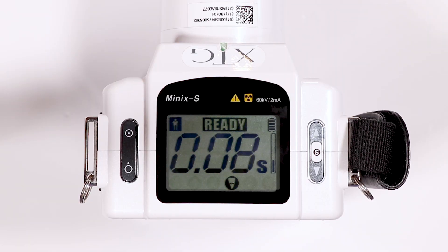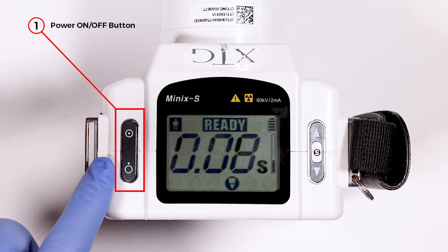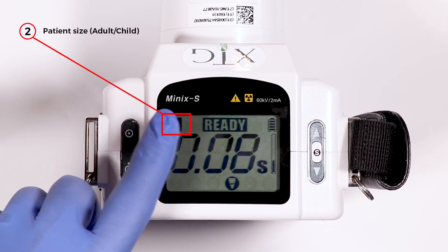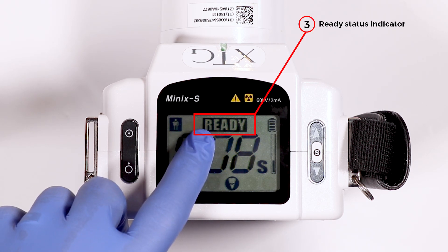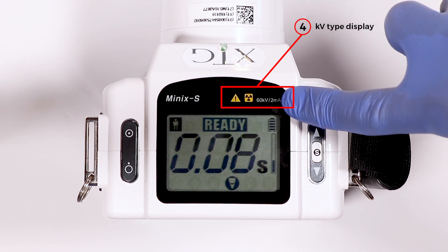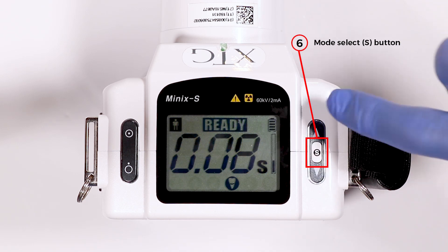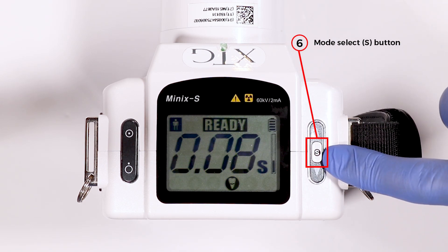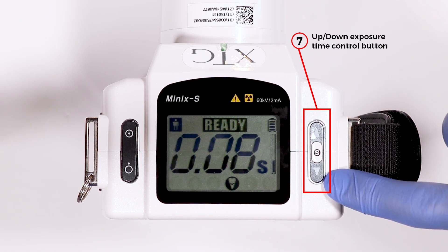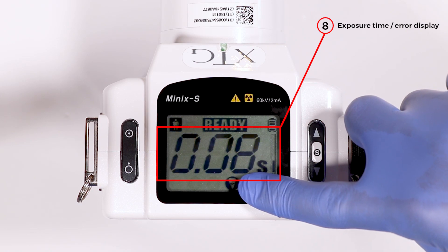The control panel and display: number one position is power on and off. Number two is patient size for adult and child. Number three is the ready status indicator. Number four is the KV type display. Five is the battery charge indicator. Six is the mode select, the S button.